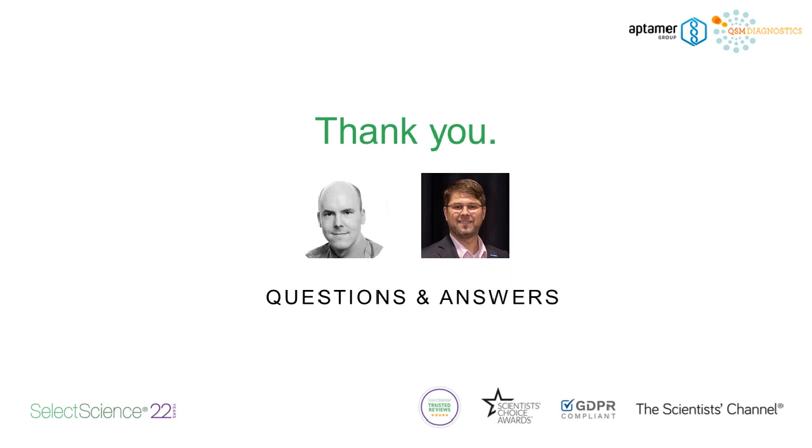Thank you. Another question, again, possibly for you, is the sensor reusable? Generally, it's not reusable. There are a few different versions, but the sensor that I presented in the webinar is geared toward a single use, where the sample remains on the sensor cartridge, and then you would throw it out and grab a new one.